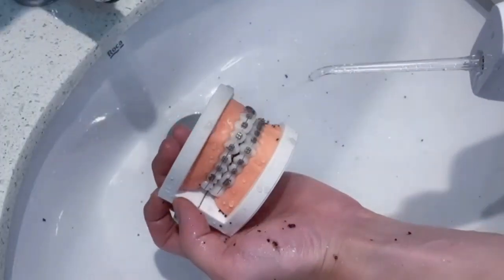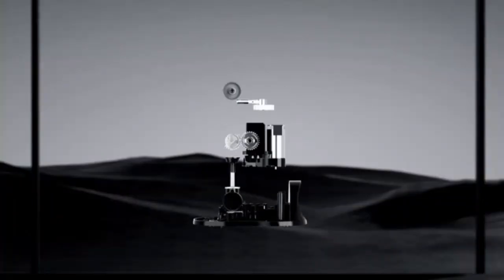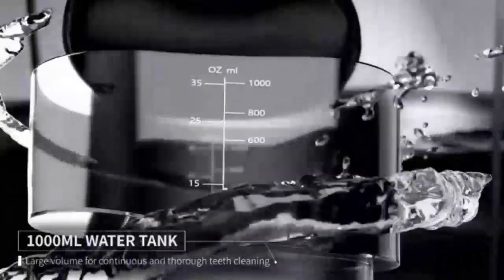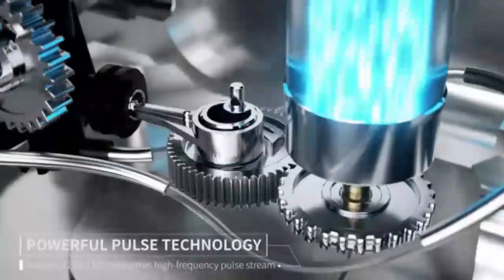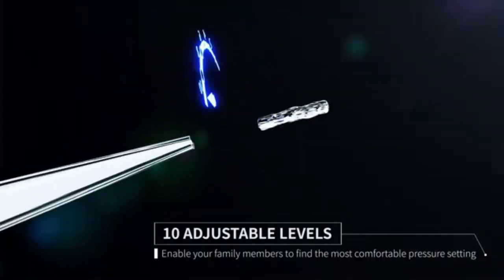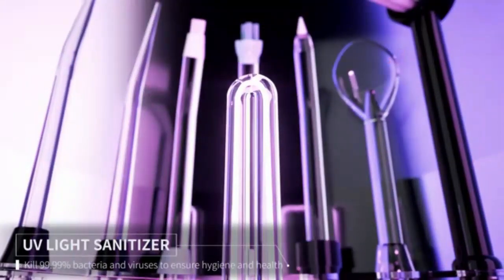Elevate your dental care routine with the MySmile LP21 UVC Sterilizable Cordless Water Flosser, designed with five cleaning modes for a personalized oral care routine. Its UVC sterilization technology ensures a hygienic experience, while the cordless design adds convenience for use at home or on the go. Paired with non-sensitive advanced teeth whitening strips, you can safely and effectively brighten your teeth without discomfort. The combination of deep cleaning and gentle whitening offers a complete solution for oral hygiene, helping you maintain a sparkling smile every day.